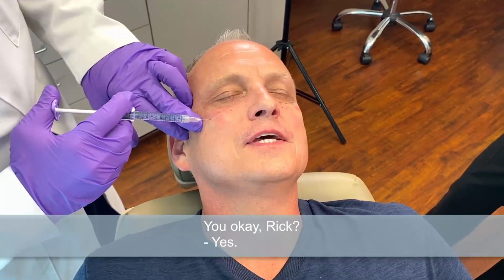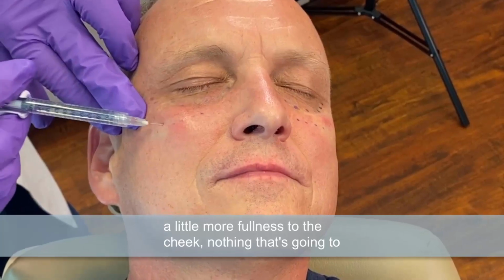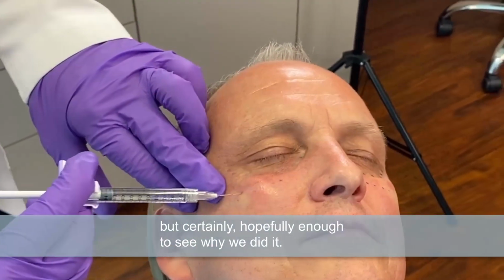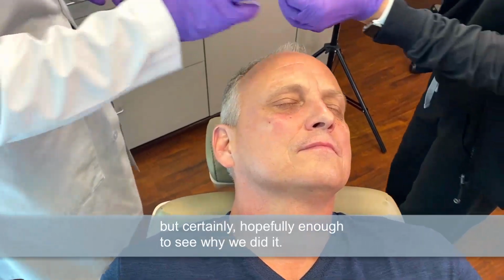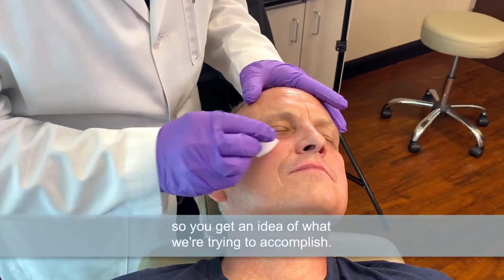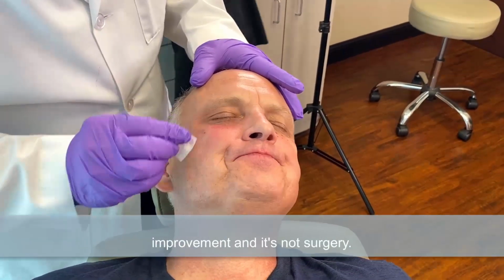You okay, Rick? Yes. Okay, great. And this is going right on top of the bone to just give a little more fullness to the cheek. Nothing that's going to be noticeable to anybody who doesn't know Rick, but certainly hopefully enough to see why we did it. Thanks, Brenda. Okay, we're done on that side. We're going to sit you up in a minute so you can see one side completely done and one not, so you get an idea of what we're trying to accomplish. Again, it's not a miracle, but it certainly gives a subtle improvement, and it's not surgery.